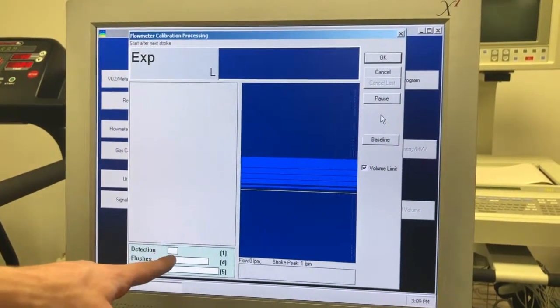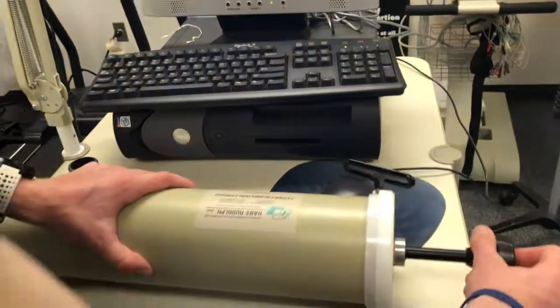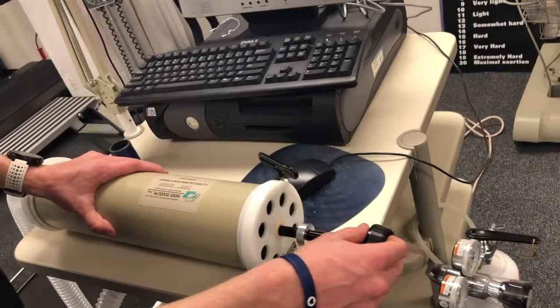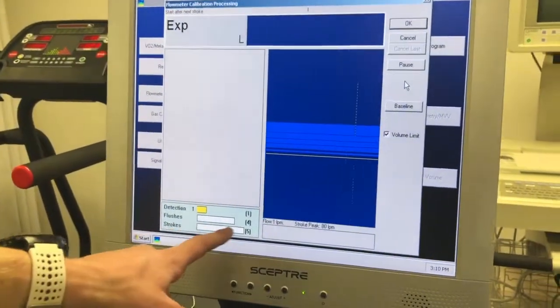First we're going to do a detection flush — pull the plunger all the way out and then push it all the way back in. Next we're going to do four flushes.